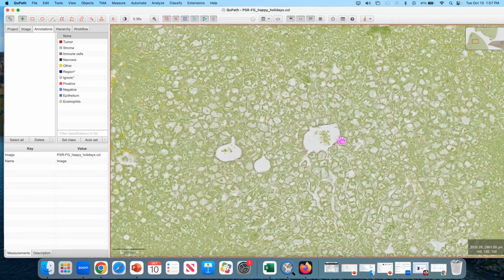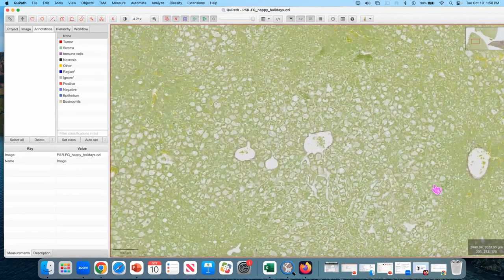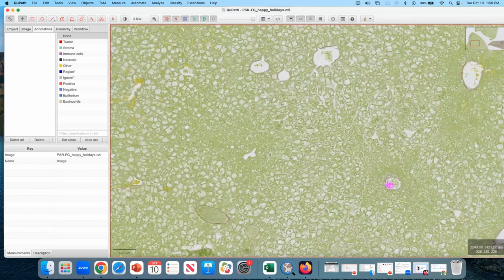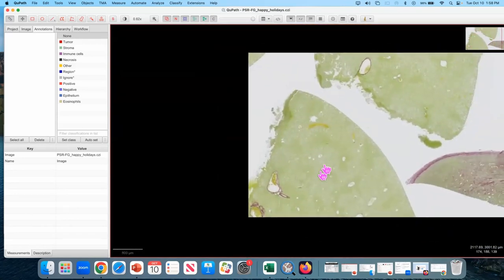Here's some red cells inside that vessel. And every tissue has its own organization and there are different ways to think of different tissues. But the liver is one of my favorites because there's a geometry to the liver. And it's somewhat apparent here. It's much more apparent in a pig that has a little bit more collagen in its liver. But if you Google something like liver lobule, zone, hexagon, you'll see where this pattern is coming from. Essentially, in zone three, I believe it's zone three, make sure I'm not getting this reversed. Yeah, so there are some smaller structures here that tell me that this is a portal vessel. And this is zone one. And then as you get further out from zone one, you get to zone two and zone three. Long story short, these vacuolated hepatocytes are occurring more along zone three. So that's one interesting thing.